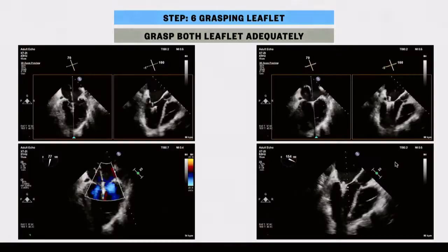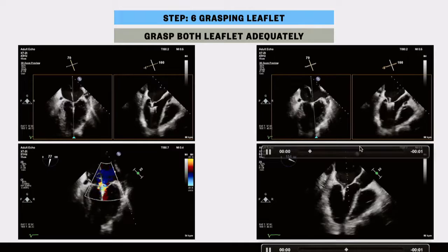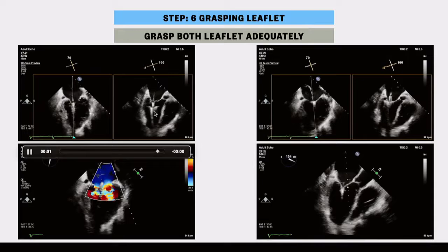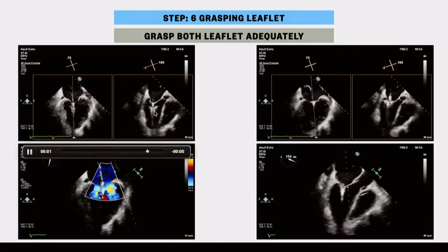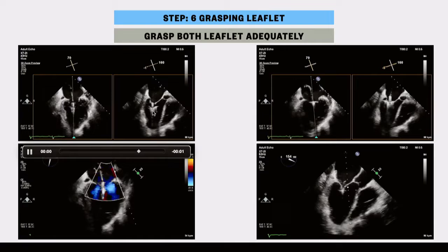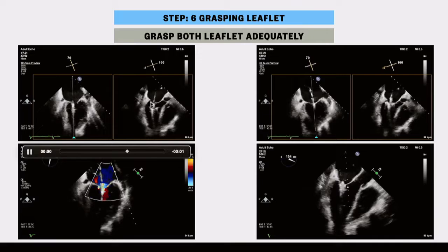Cross the mitral valve and open the clip arms — the opening depends on which clip is being used: NTR, XTR, or the new G4 clip including NTW and XTW. Open the clip arms, pull back the clip, and let the anterior mitral leaflet and posterior mitral leaflet rest on the clip arms. Once satisfied, drop the grippers and close the clip, then assess the mitral regurgitation.